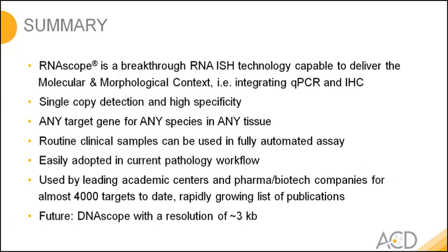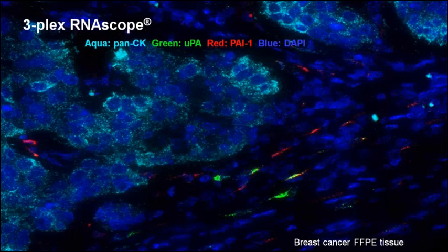So at the very end, I would like to share one very nice image with you. This is an image from a formalin-fixed tissue slide, breast cancer. And you may or may not know that there is a clinical test that is done on 300 milligrams of fresh breast cancer tissue. And it is an ELISA test testing for uPA and then PAI-1, so plasminogen activator. And the background is that there were microarray experiments that indicated breast cancer can have higher levels of plasminogen activator, and those patients with elevated plasminogen activator are more prone to metastasis.